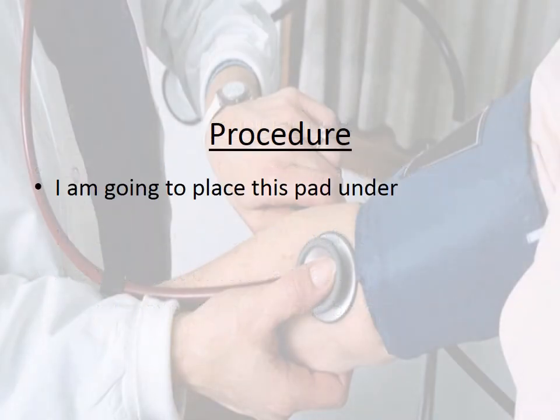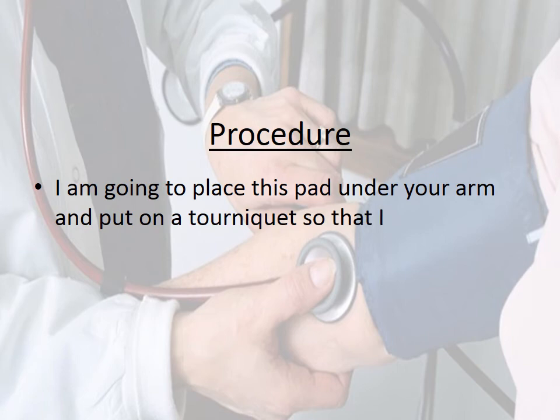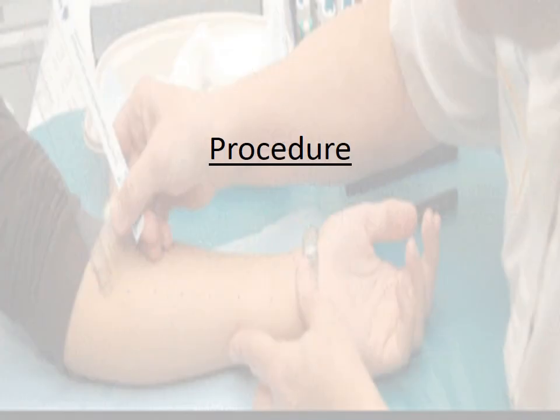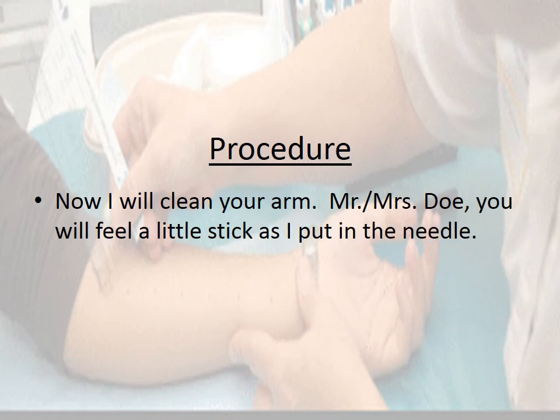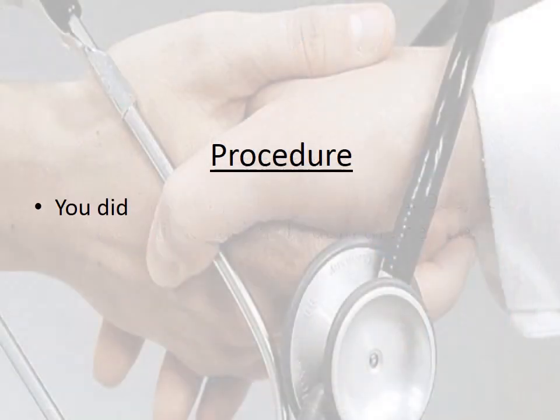I'm going to place this pad under your arm and put on a tourniquet so that I can see your veins better. Now I will clean your arm. You will feel a little stick as I put in the needle. You did great!